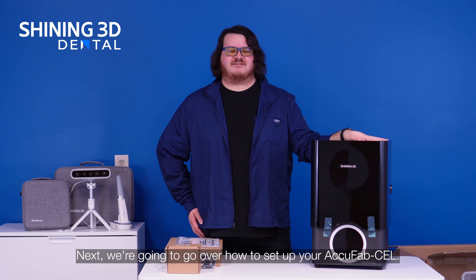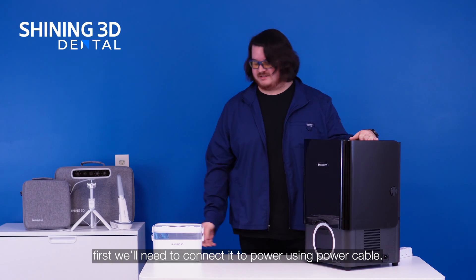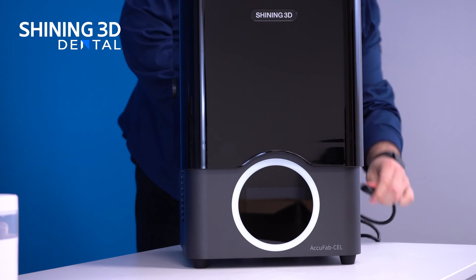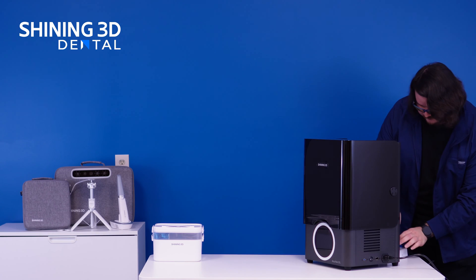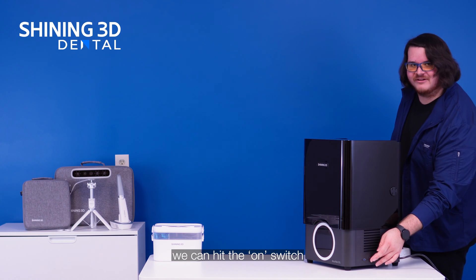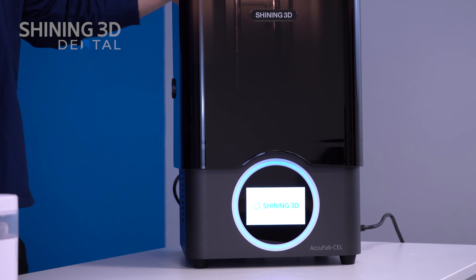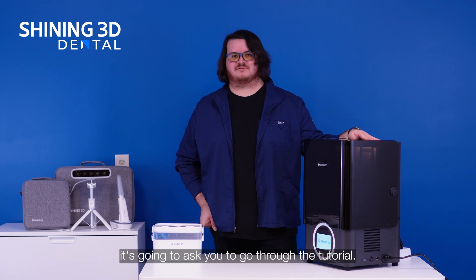Next, we're going to go over how to set up your AccuFab cell. First we'll need to connect it to power using the power cable. After connecting the power, we're going to hit the on switch and the machine is going to power on. On first time boot, it's going to ask you to go through the tutorial.